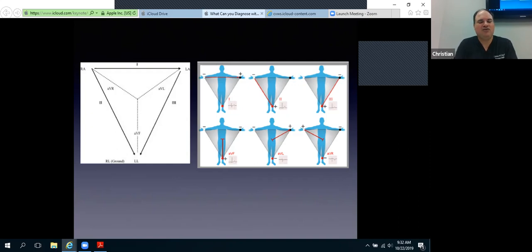You got to get that part right first. And then we look at the way the limb leads are done, right? So the leads are applied, but rather the electrodes are applied, and a lead is defined as a bipolar event, meaning there's a negative and a positive between those two. And you can reverse all of these, right? So you just have one electrode and you decide, well, which direction is the negative and which one's the positive.